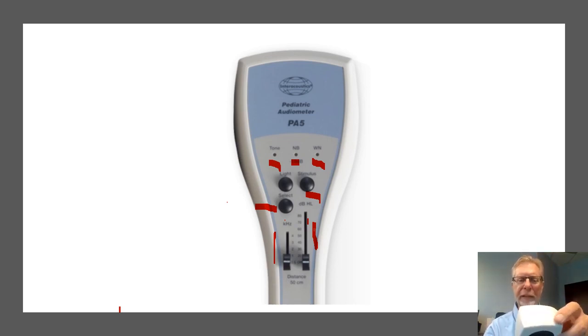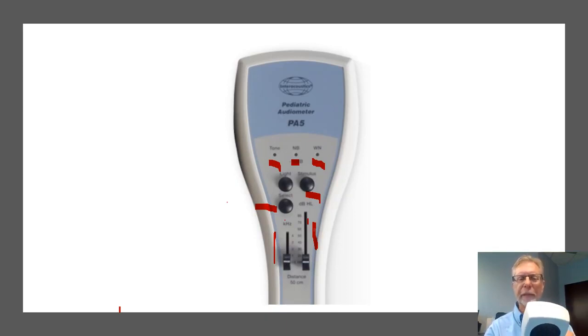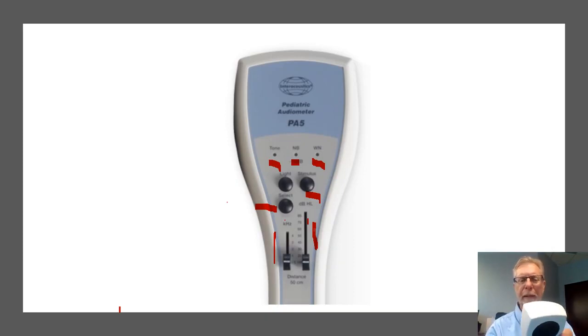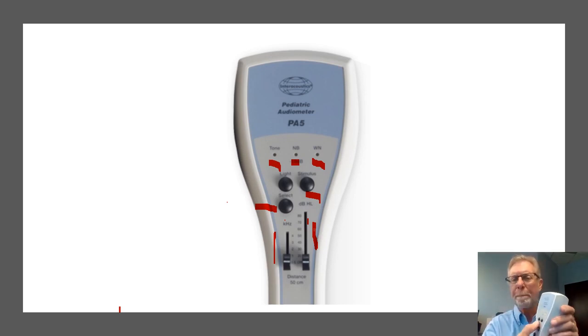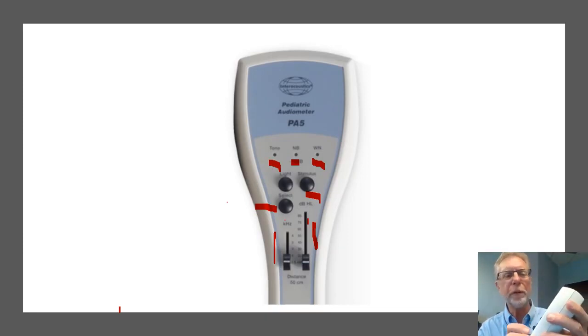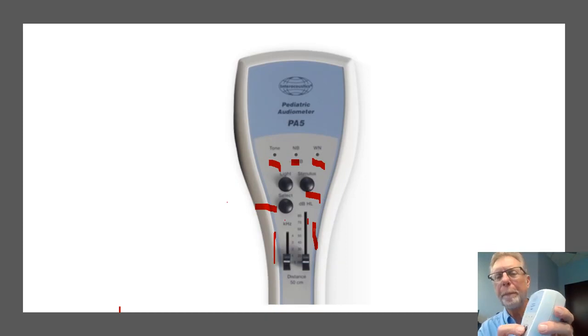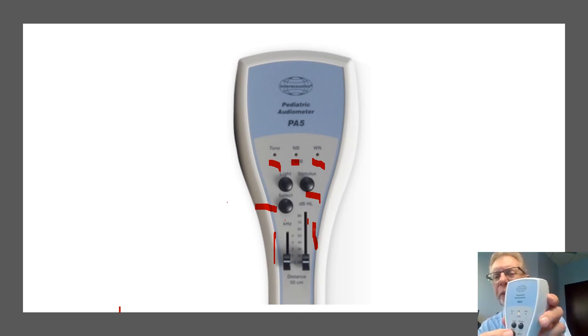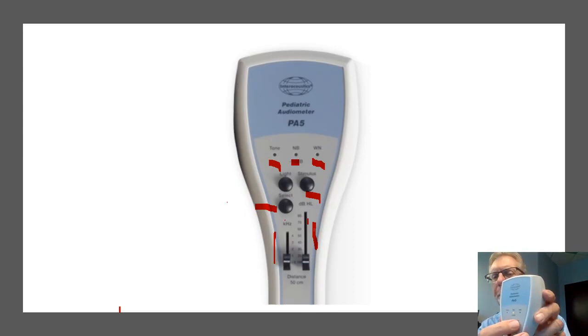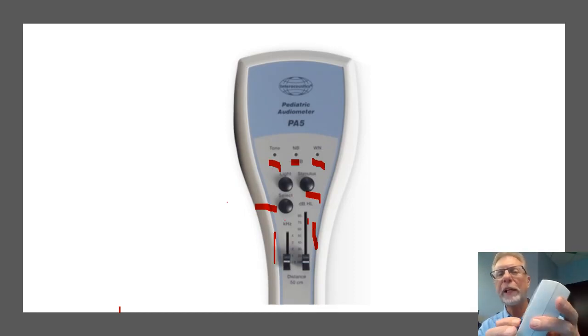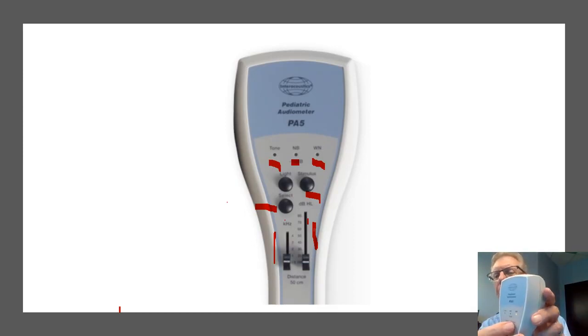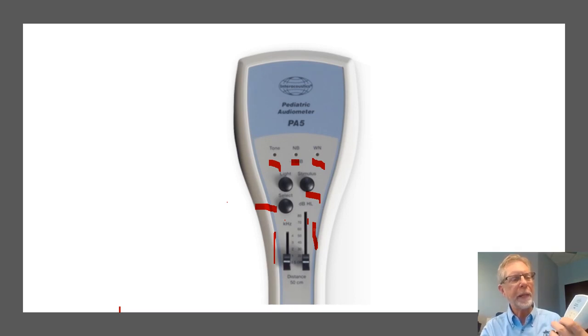Here, I've got the instrument turned on, and I've turned it up to 70 dB so you can hear it. And when I hit the stimulus button, I'll have it on narrow band. You see how I'm able to switch between a tone and, or I can switch to a narrow band. And when I do that, and when I go to white noise, so that's the stimuli that they have.